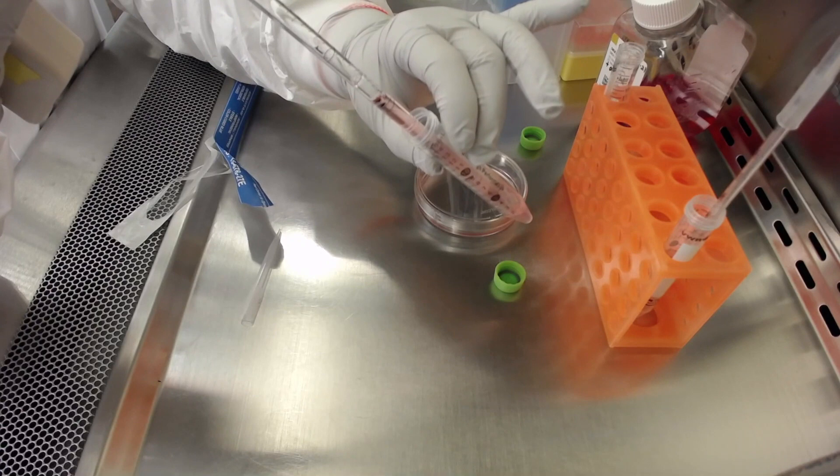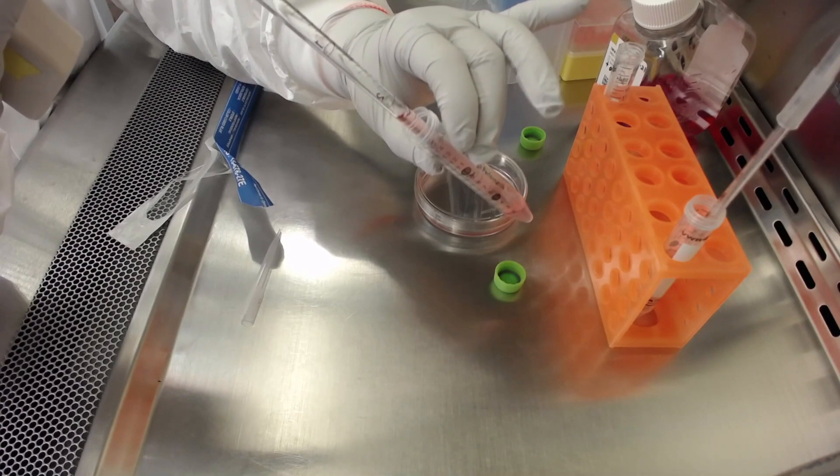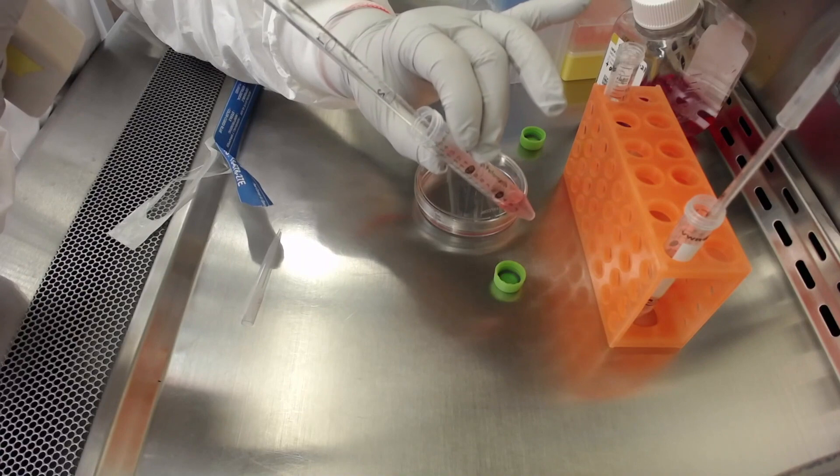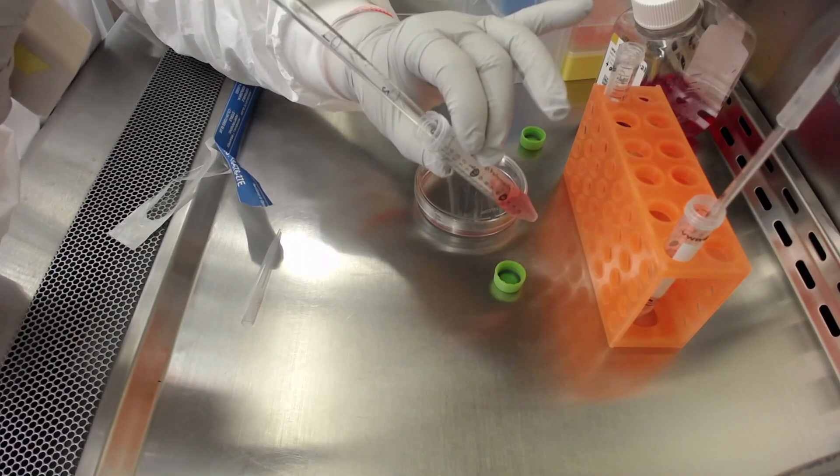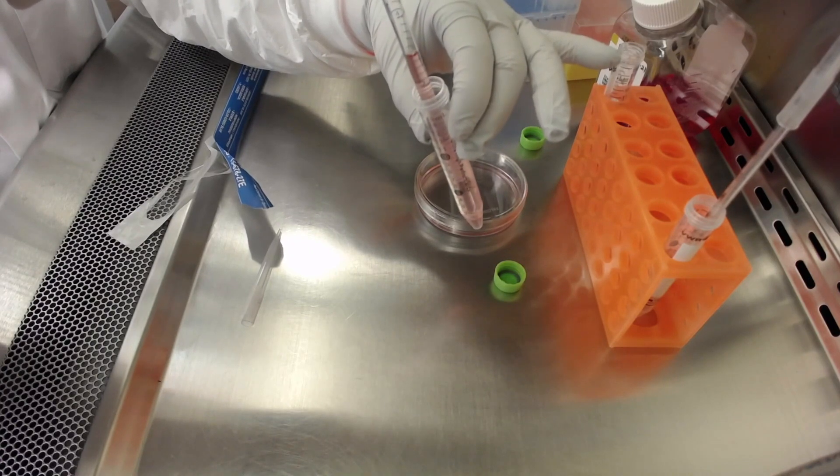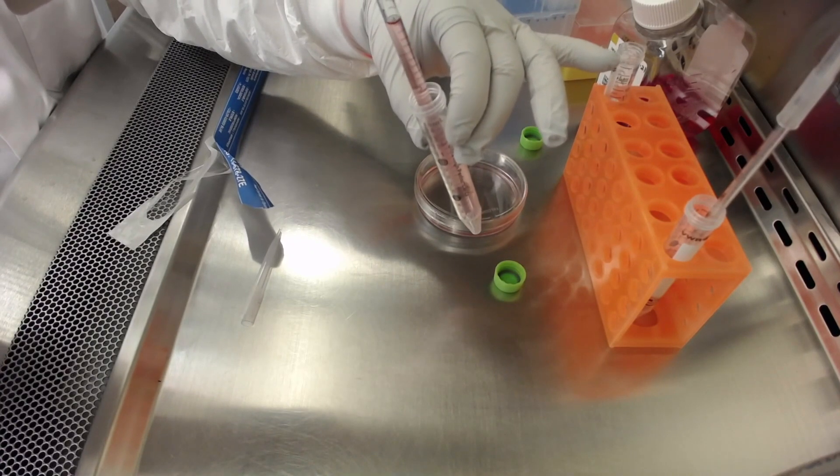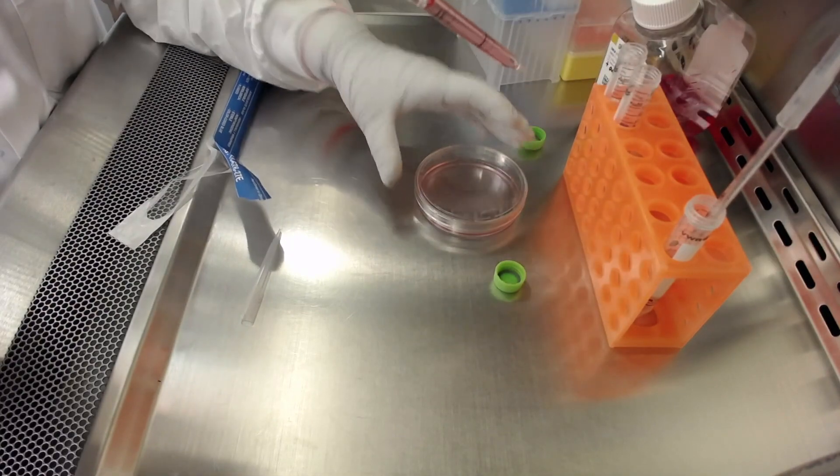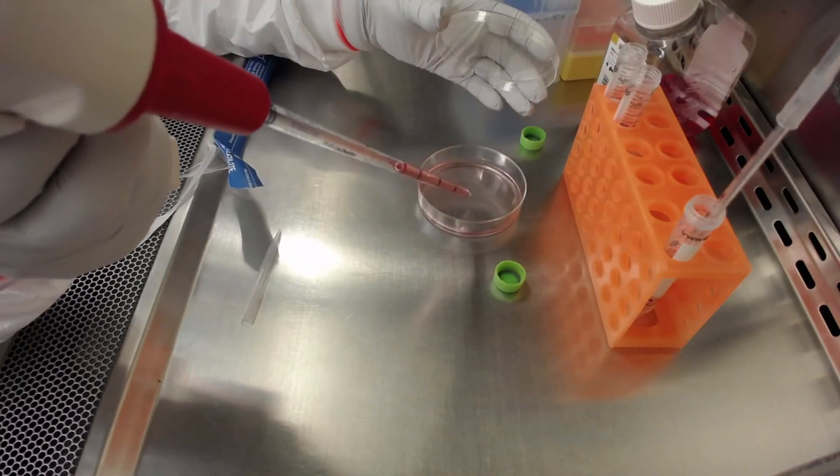Using a 5 milliliter glass serological pipette, re-suspend the cells in the 2 milliliters of media previously added to the tube. When re-suspending the cells, it is important to be gentle in order to preserve the cell clumps and to avoid making a single cell suspension. We advise to pipette the cell suspension up and down no more than 5 times.